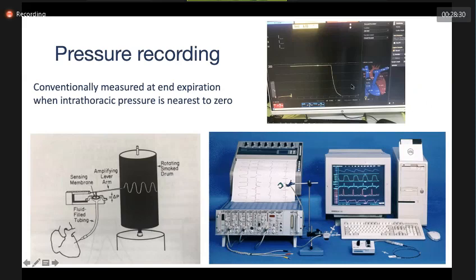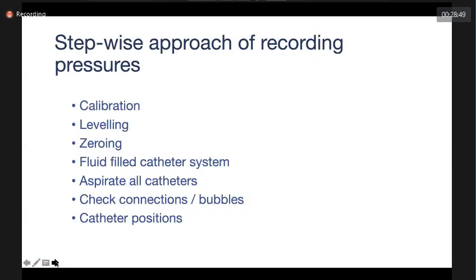That's why now everybody has switched over to this kind of conversion straight away, where the kinetic energy will be converted into electrical signals in the computer. You will get the proper transducer or a proper waveform.